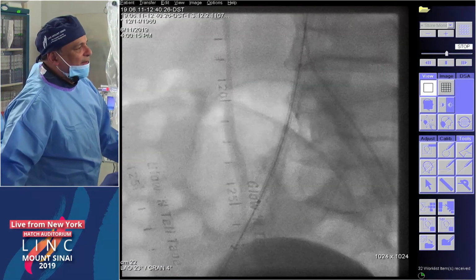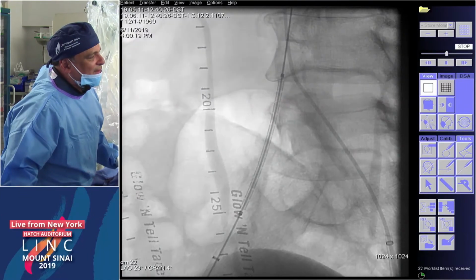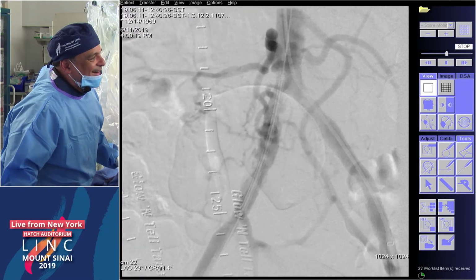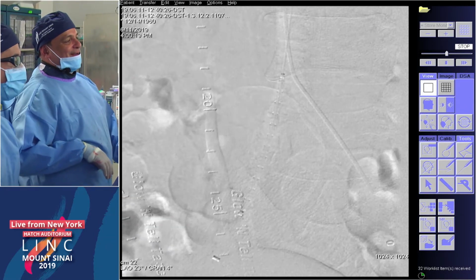Yep. Let's take another look here, guys. We got a normal creatinine, so we'll take a little advantage. Your bladder's catching up to your hypogastric now. I think that's a good position. All right, we're going up here. Time for a Foley catheter. Nominal?